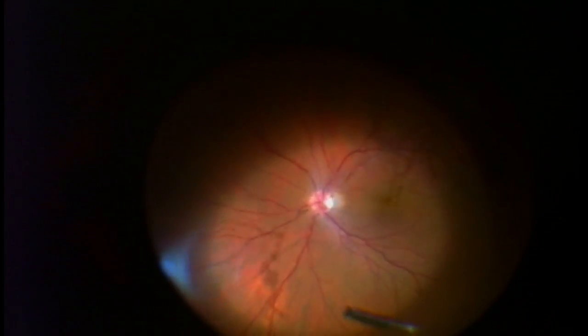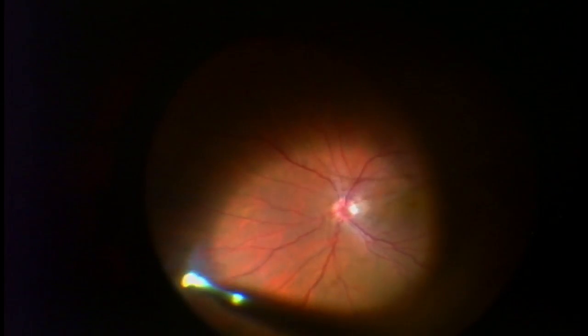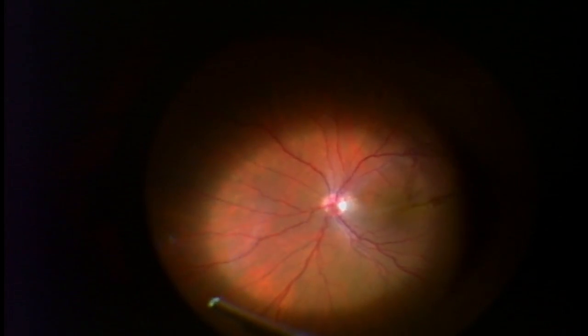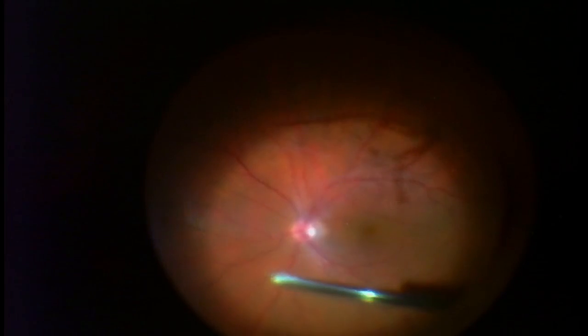Now you can see the confluent vitreous off to the side, but the real culprit is this gigantic central spider that's moving across her macula, which gives her some really annoying and debilitating changes in her vision.